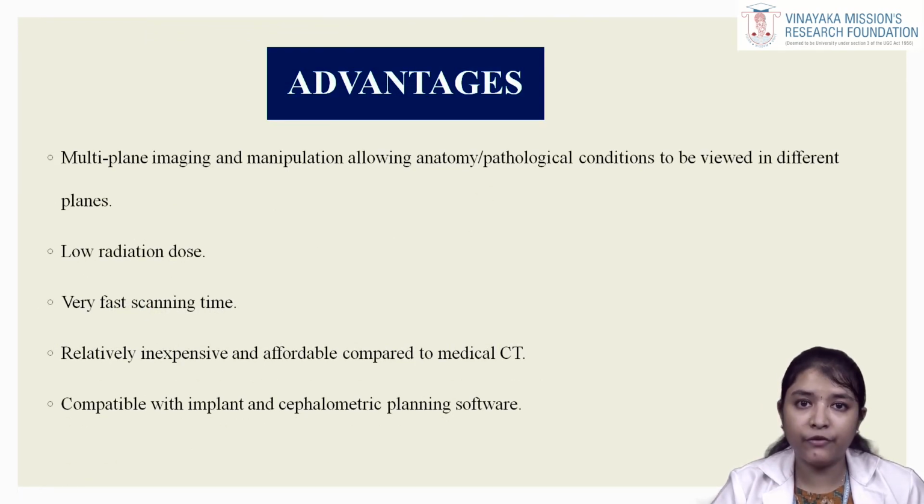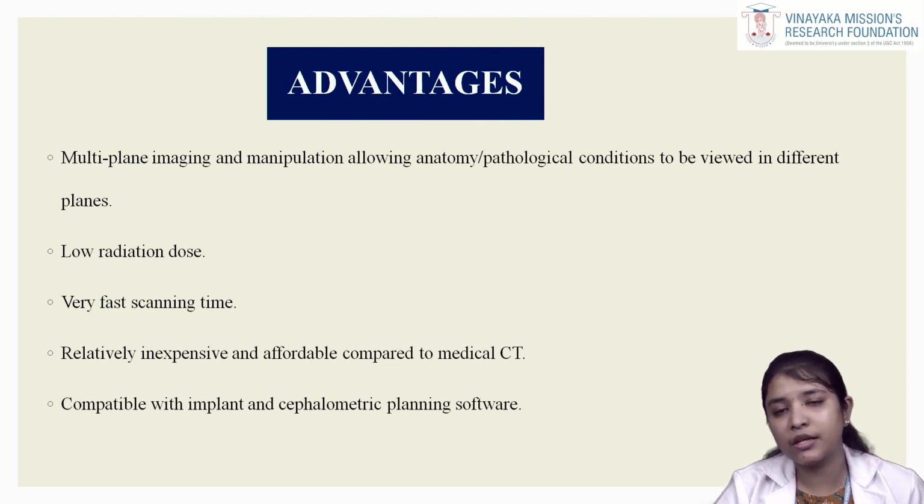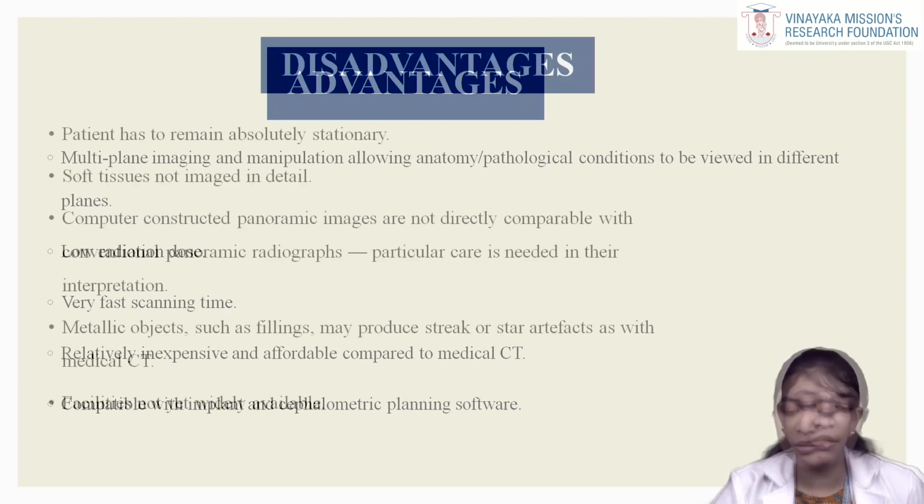Advantages, as I said before: it is used for anatomical purposes, and it can be used in pathological conditions. It has a low radiation dose and faster scanning time, and it is inexpensive and affordable. And in the case of implant planning and cephalometric analysis, CBCT software can be used.